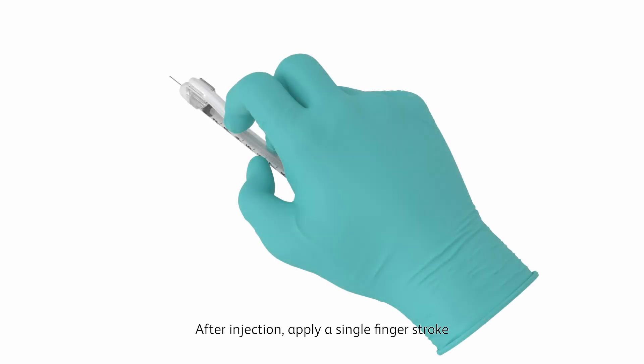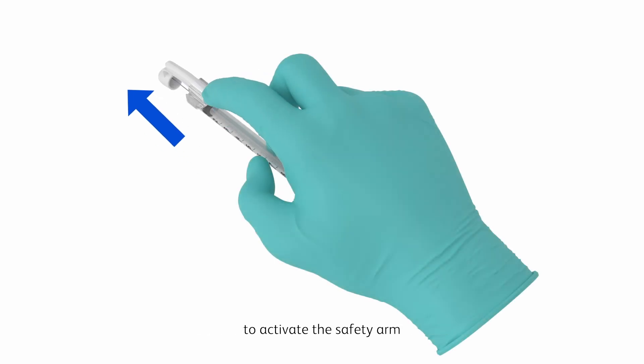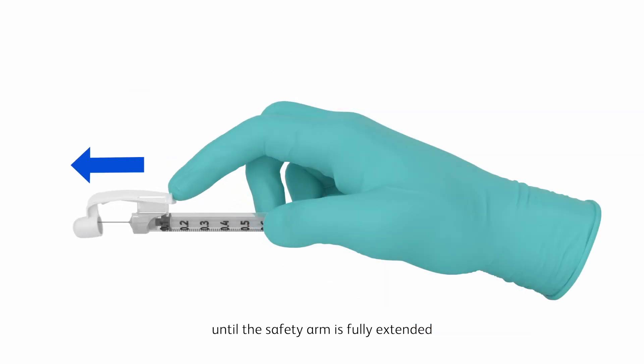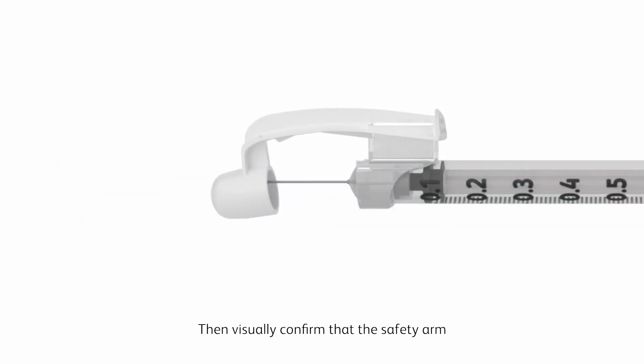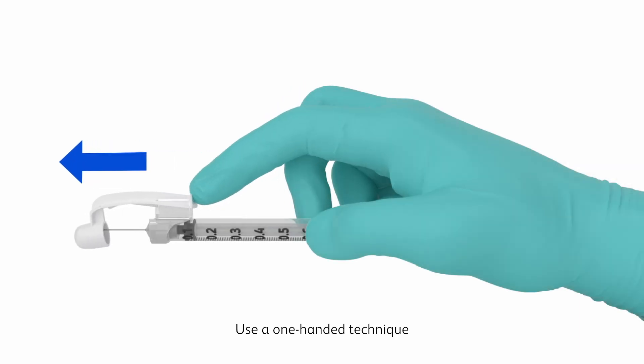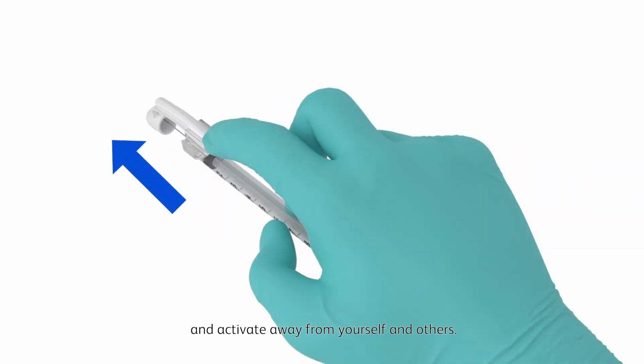After injection, apply a single finger stroke to activate the safety arm by moving it completely forward until the safety arm is fully extended and the needle tip is covered. Then visually confirm that the safety arm has fully advanced and the needle tip is covered. Use a one-handed technique and activate away from yourself and others.